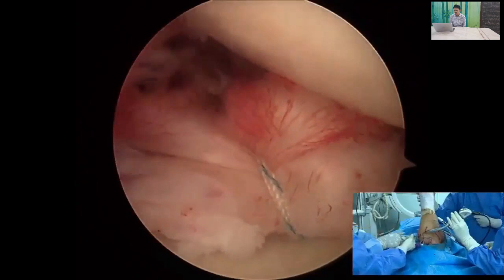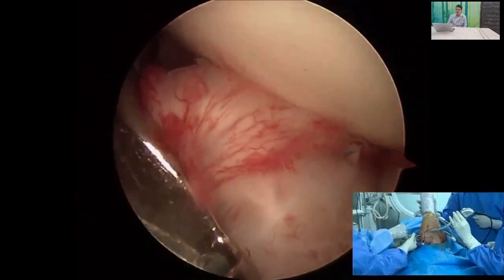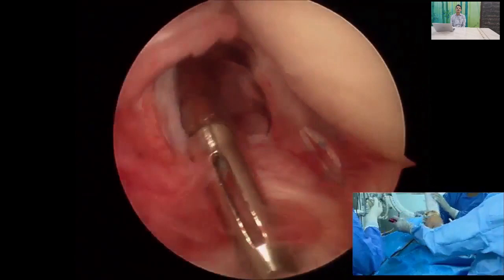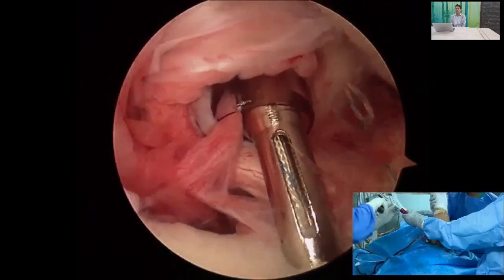At this point, you will notice the Hill-Sachs lesion has moved posteriorly and is no longer in the way. It is imperative to place at least three anchors — with fewer than three, the recurrence rate is high. The third anchor is placed at approximately the 3:30 o'clock position.